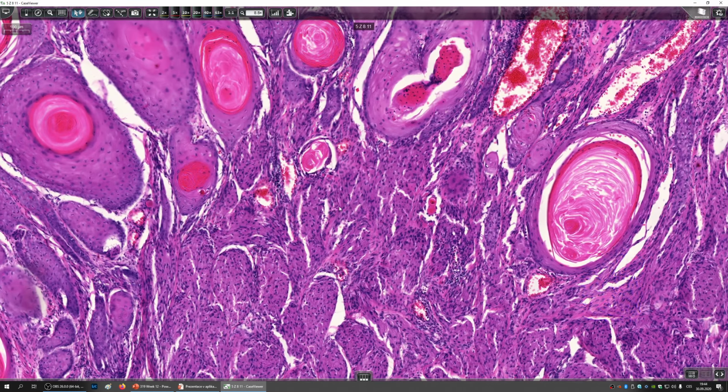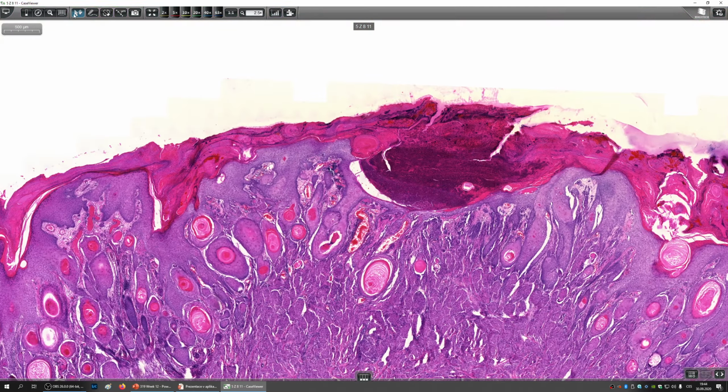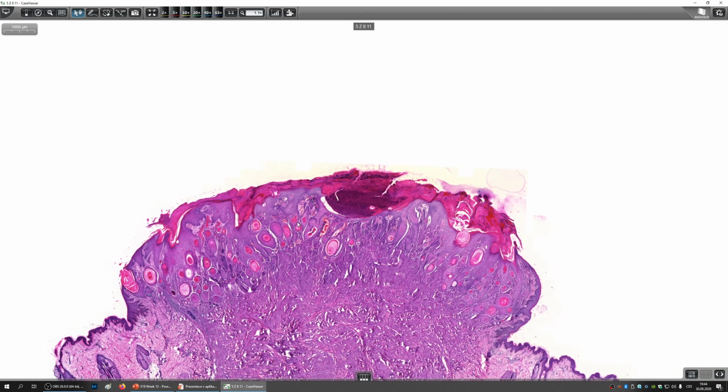So the first groups of granular cell tumor are here. They are quite deep. Let's measure the depth. So they are 2 millimeters deep. So you need to take quite a deep biopsy to find them. So this can be a pitfall in esophageal tumors, for example. The pathologist can also be fooled by this hyperplastic epithelium and say that this is well differentiated squamous cell carcinoma. So this is the only pitfall that I can think of.